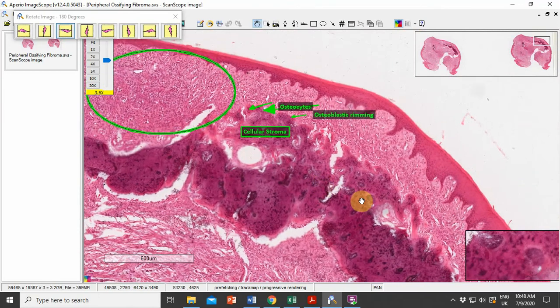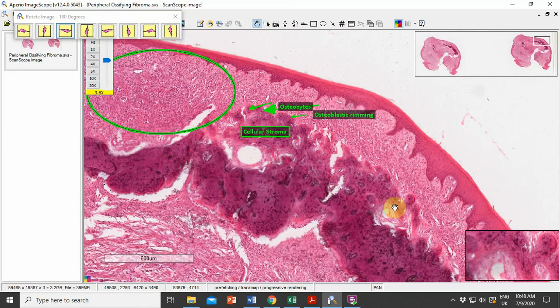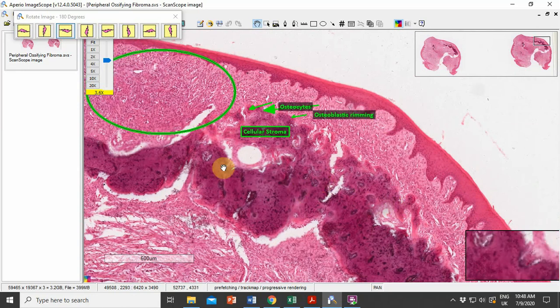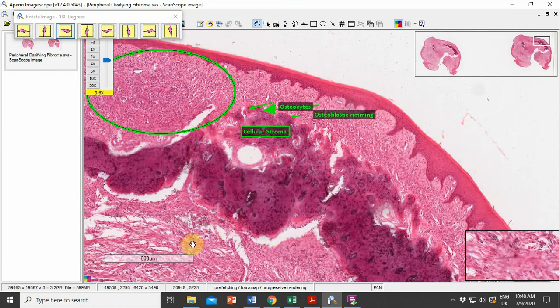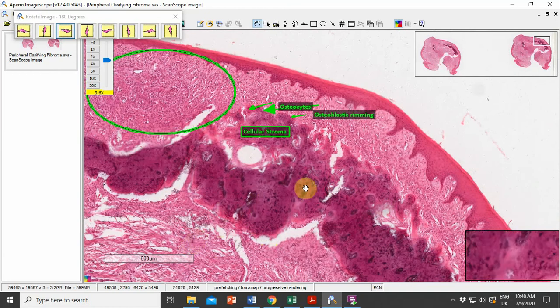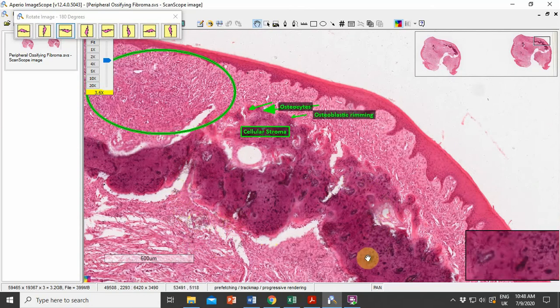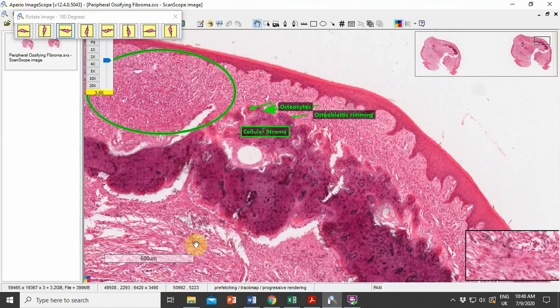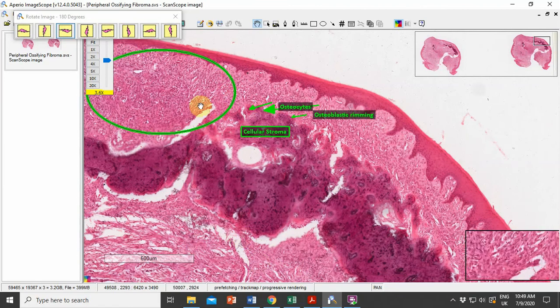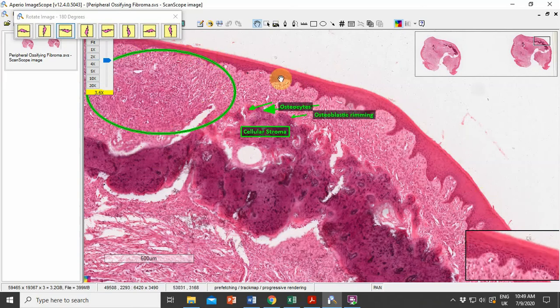These features are suggestive of peripheral ossifying fibroma. To identify a lesion as a peripheral ossifying fibroma, we must remember that the connective tissue will show numerous densities of mineralized product — specifically, irregular trabeculae of bone surrounded by a cellular stroma. The overlying epithelium may show atrophic changes or may sometimes be ulcerated.